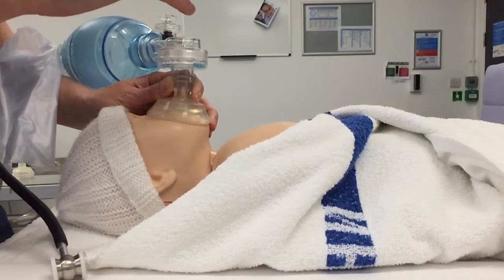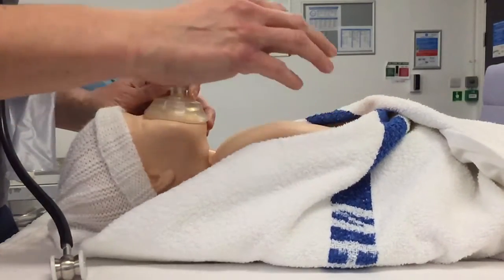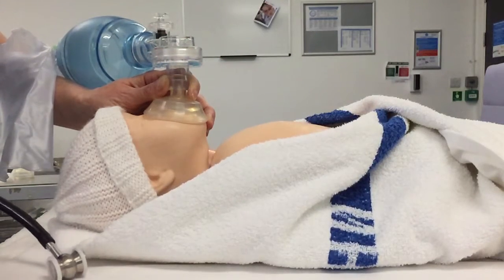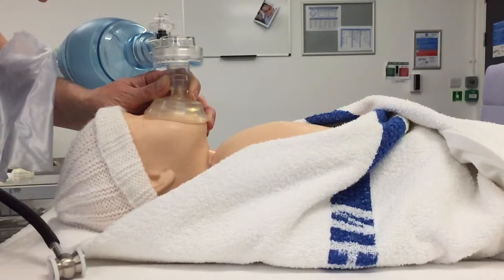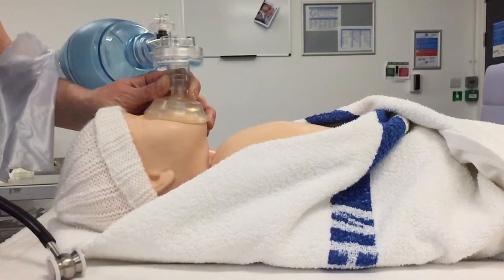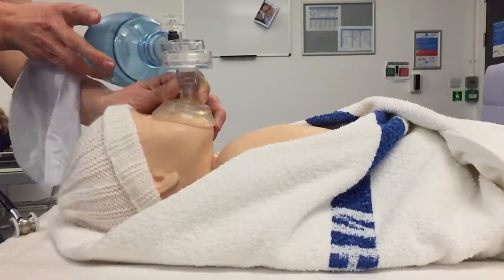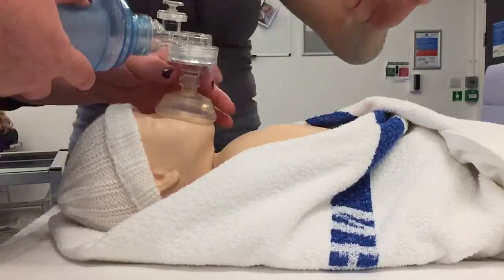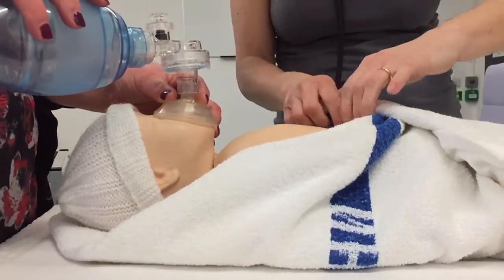So I have seen chest rise on this baby, so I know I've got air into the lungs, but the baby's heart rate is slow. So I need to do chest compressions on the baby. I could do 30 seconds of ventilation breaths if I wanted to, but I'm going to move straight onto chest compressions. I would need an assistant to do this normally — so I can be your helper. Can you take the airway for me? I'm going to do three compressions to one ventilation breath, which is just a short breath.